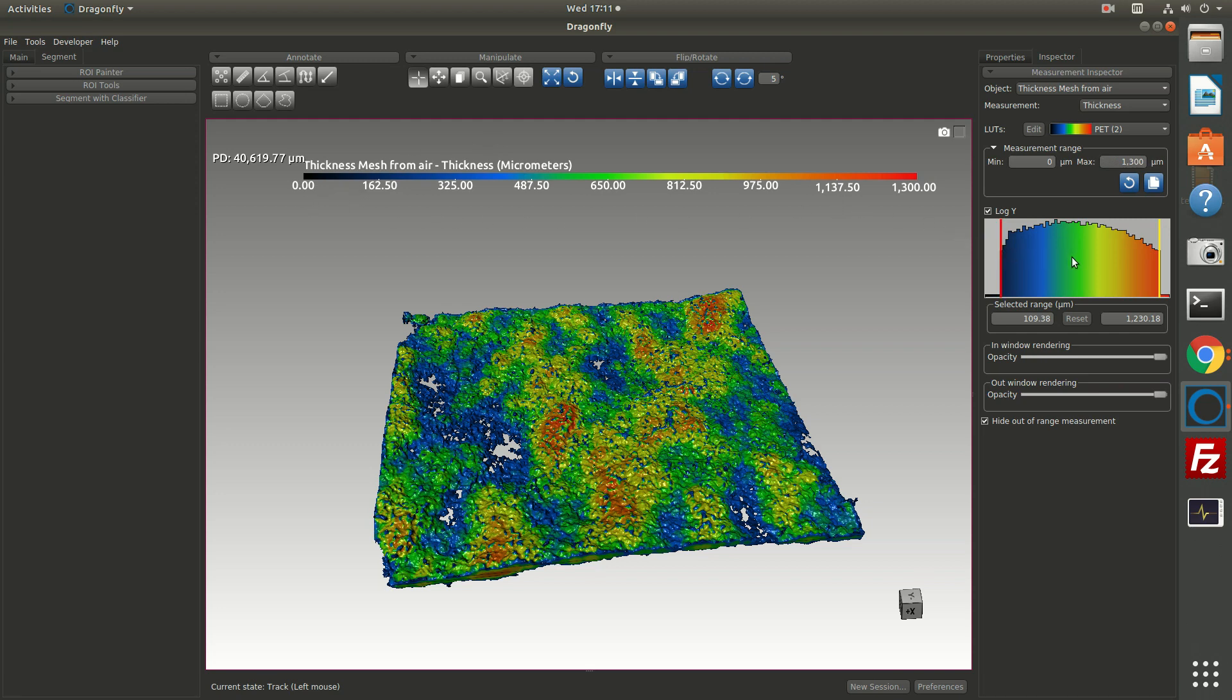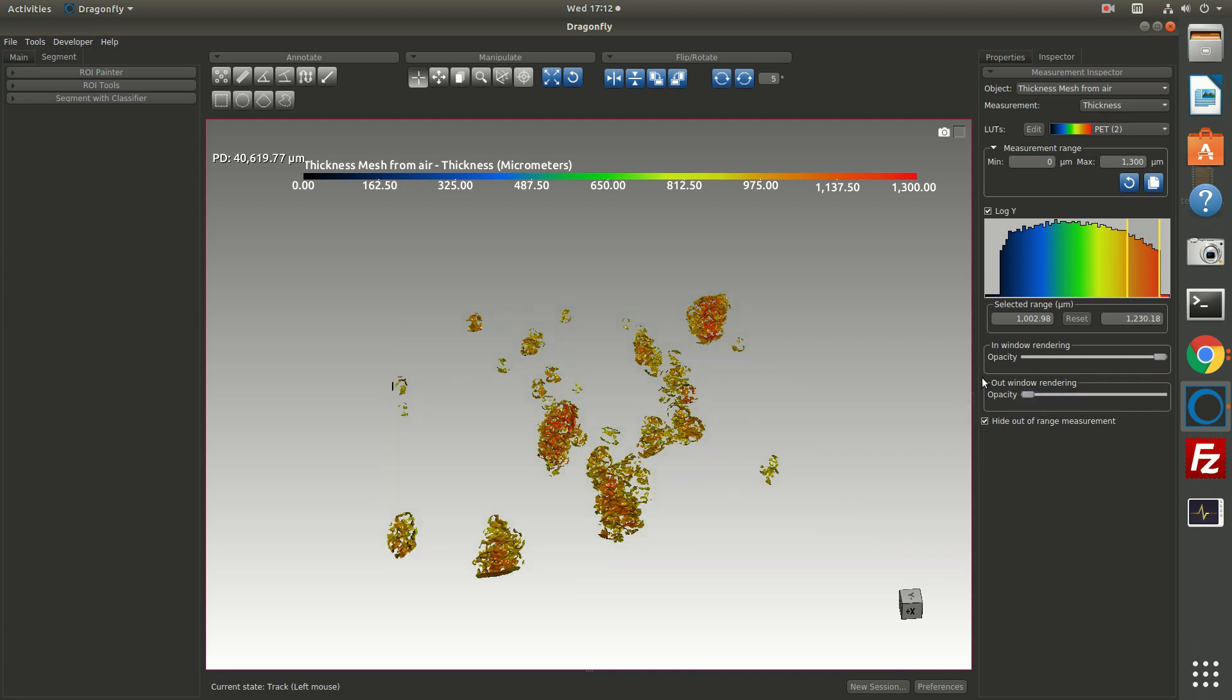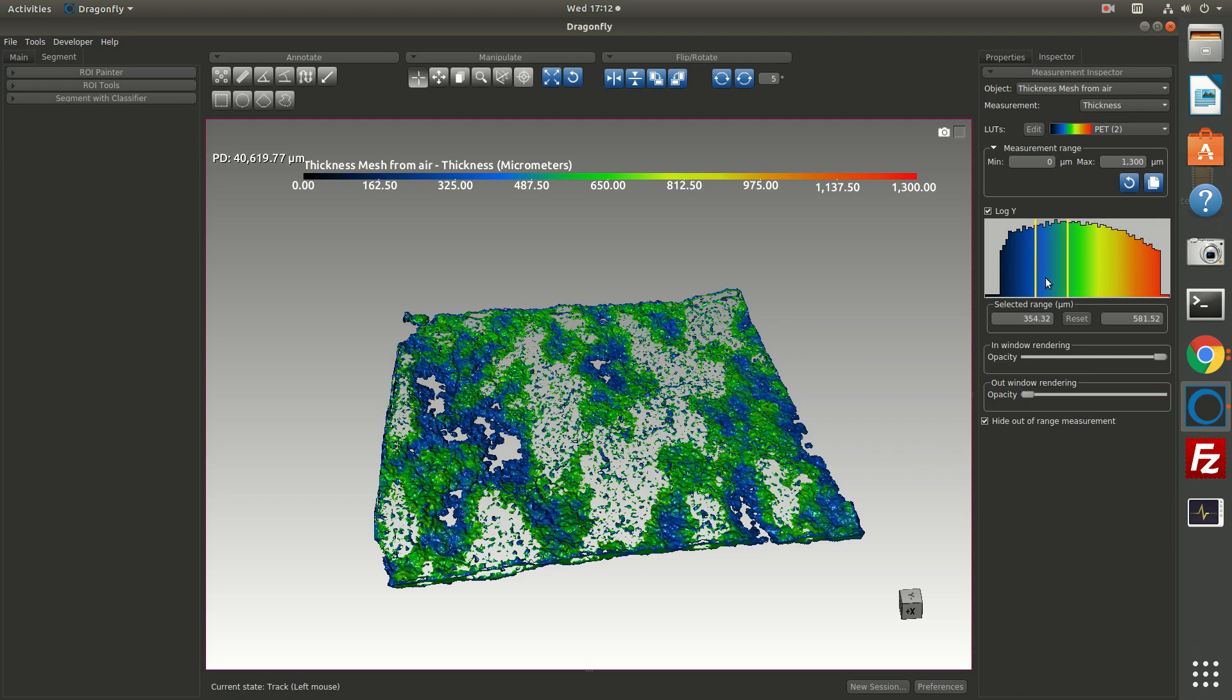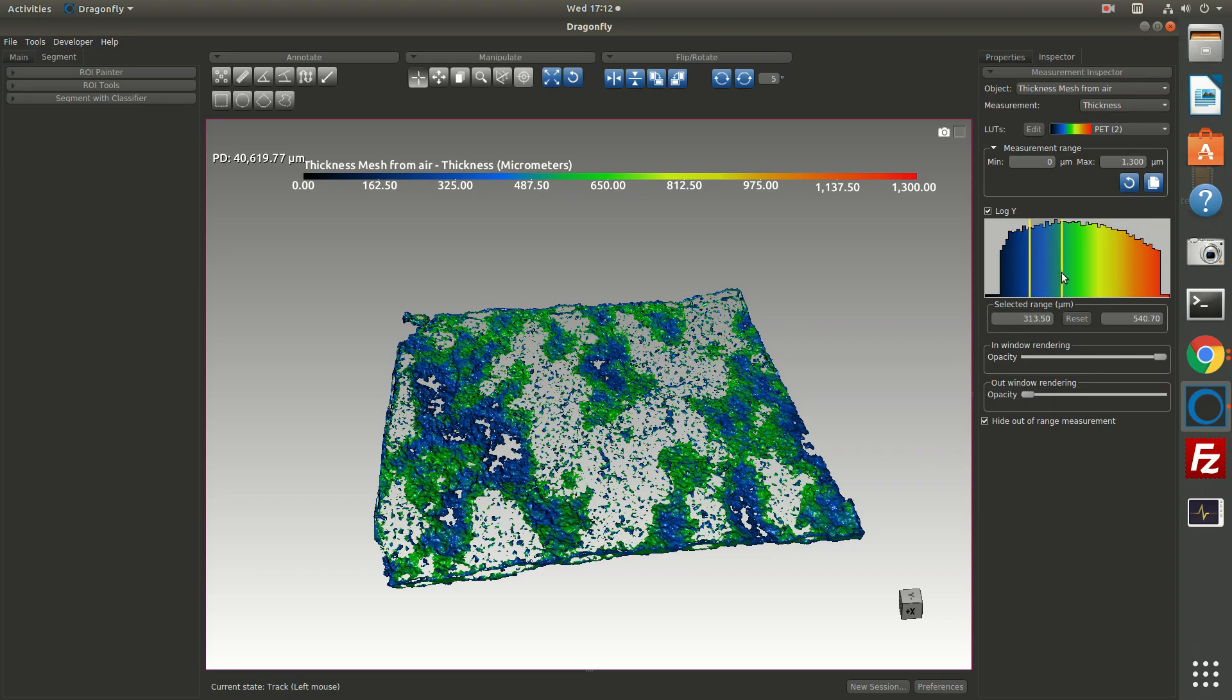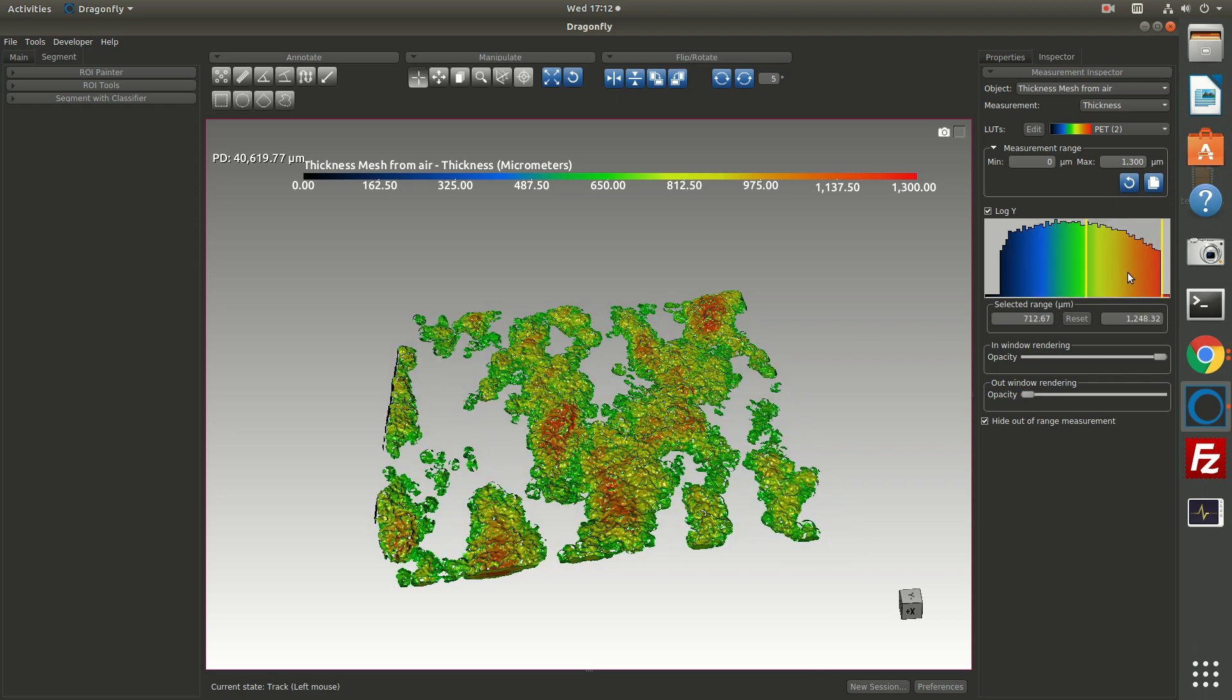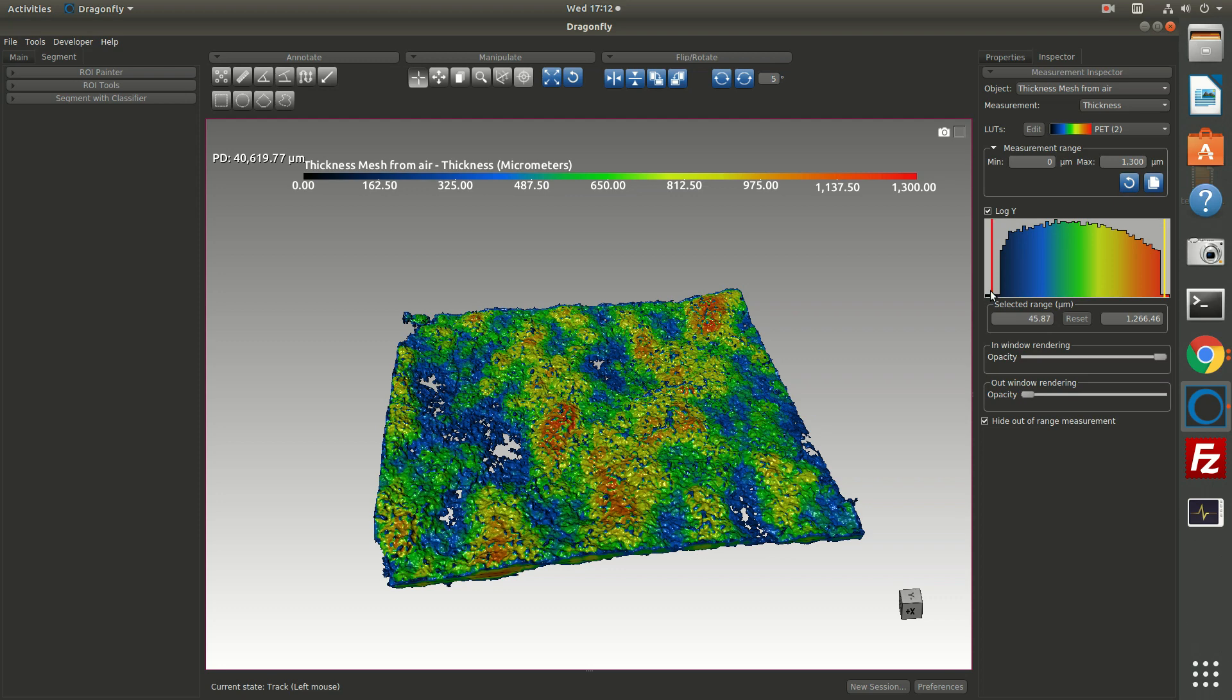And then what I can do in here is I can choose to look at just a particular area of measurements. And what I mean is, suppose I'm only interested in the thick parts of my thickness mesh. I can say everything inside this window from here to here should be 100% opacity, and everything outside the window should be 0% opacity. And now I'm looking at just the thickest parts of the mesh, or just the thinnest parts of the mesh. So this allows you to interrogate a three-dimensional object based on its attributes. So it makes it very easy.